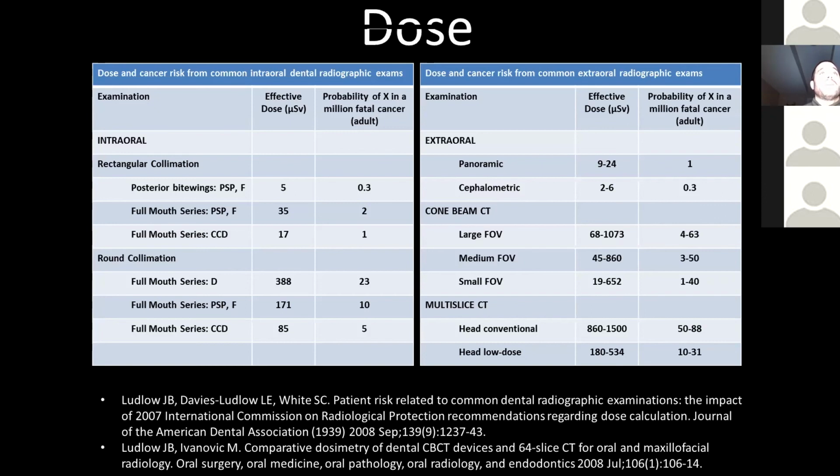So if you're trying to find a crack, that's a research interest of mine. The sad truth is that based on available technology right now, you still won't see all the cracks, but occasionally we get a few clues that there's a crack or root fracture going on.